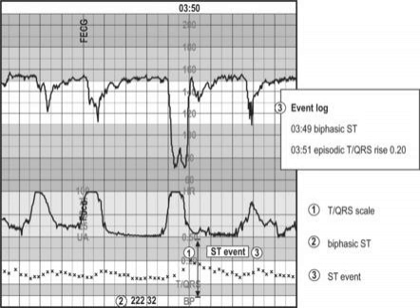Unquote. This failure to improve our ability to interpret traditional fetal heart rate tracings drove so much of the research into all these techniques that we've heard about over the last 3 episodes. And consequently, the failure of these techniques to significantly change outcomes caused us to reevaluate how we interpret those tracings to begin with. And as we saw with fetal scalp pH, scalp stimulation, and fetal pulse ox, as we got better at interpreting tracings, the gains from these add-on tests become smaller and smaller. So, why don't we skip ahead here and see if the same pattern holds true for ST waveform analysis?